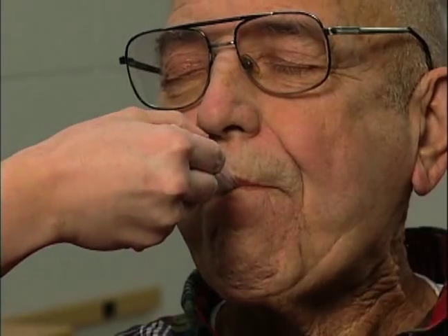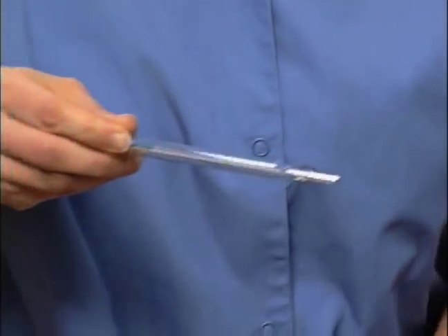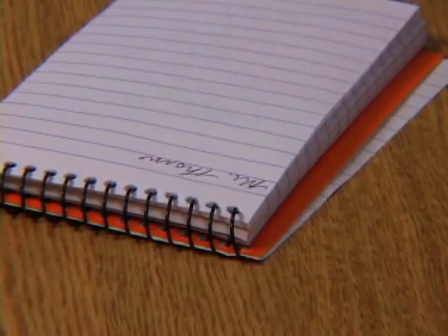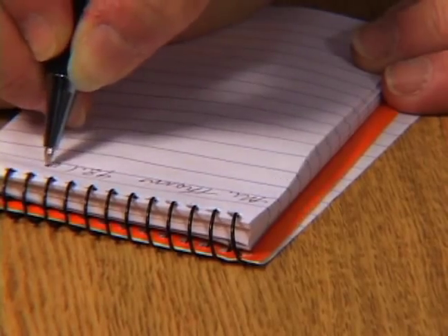Stayed with the resident during the entire procedure. Remove the thermometer when appropriate. Read the thermometer. Recorded and reported the results within plus or minus 0.2 degrees of the evaluator's recorded temperature reading.